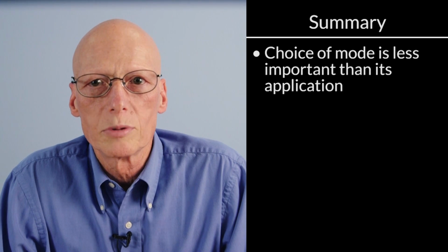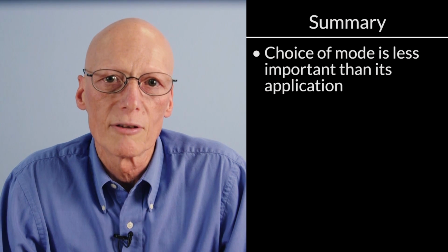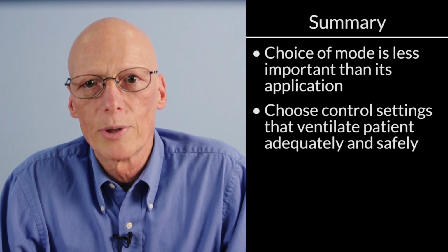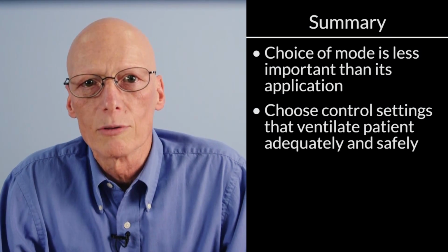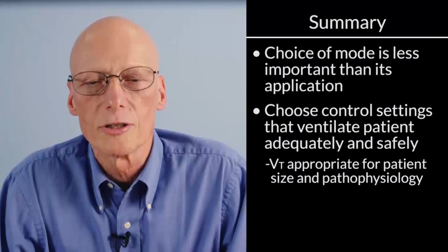In summary, the choice of mode of ventilation is probably less important than how that mode is applied to our individual patients, which means setting control settings that ventilate our patients adequately and safely. And one of the prime concerns here is choosing a tidal volume appropriate to that patient's size and pathophysiology.